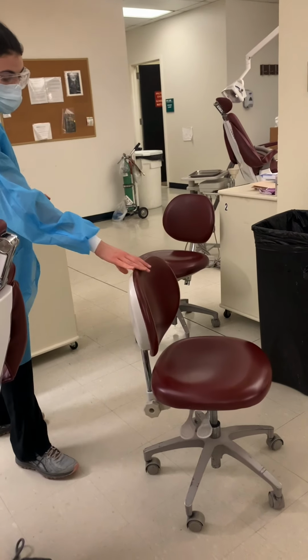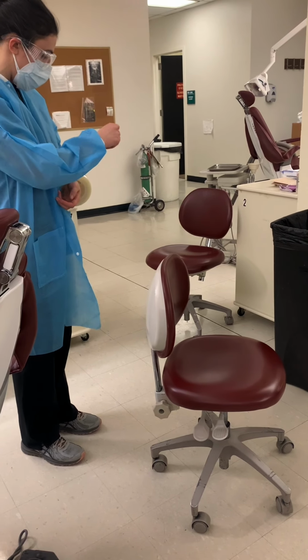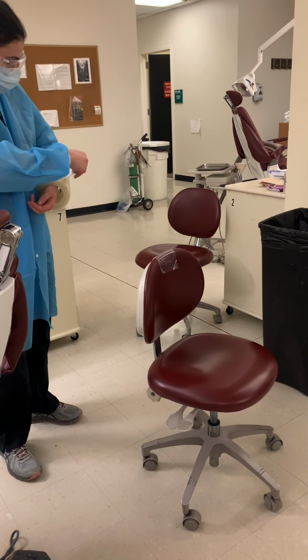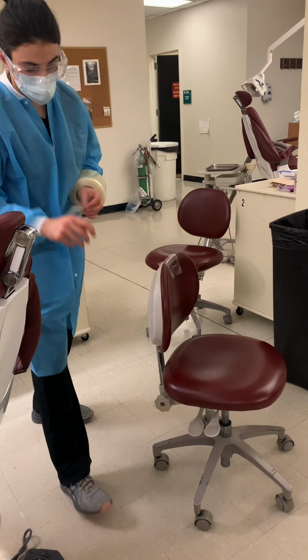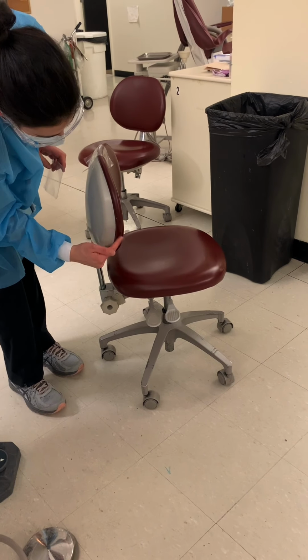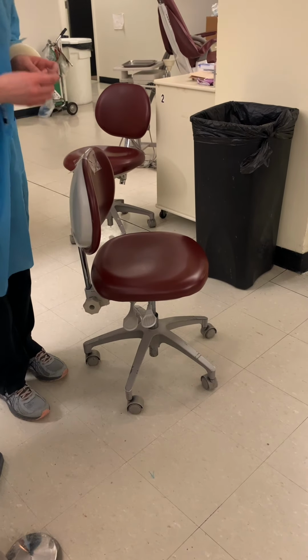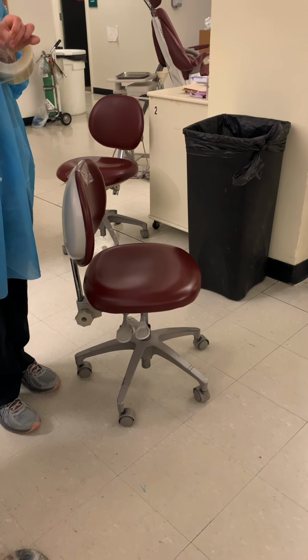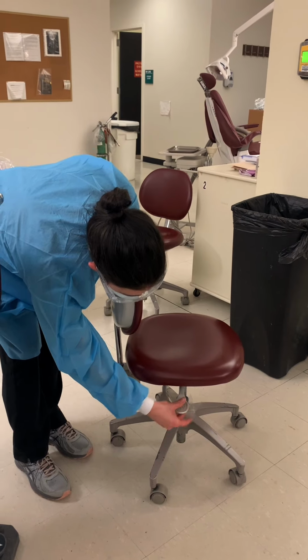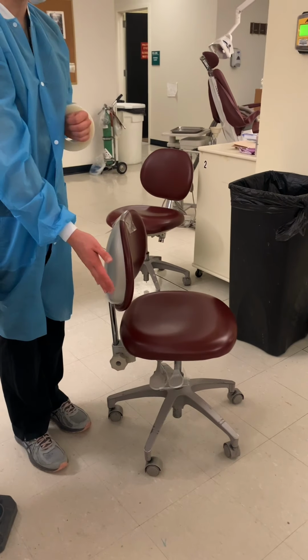And then when you are operating on the stools, one of the frequently touched areas is this, when you would move your stool. So you typically barrier here. And then if you're adjusting the up and down, we probably won't do the bottom one because that adjusts here. So we'll just do this one with the lines. Same thing, give yourself a lip and then put it over there so that if the dentist were to grab or move it during the procedure, it's covered.